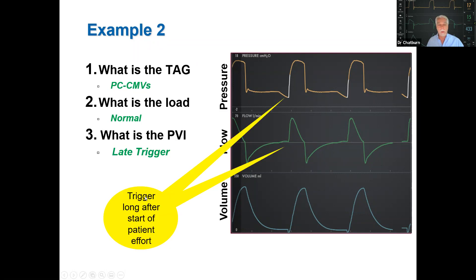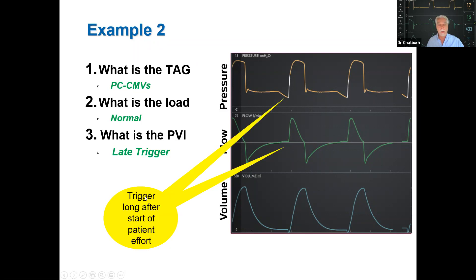Here we have evidence of a late trigger. The patient made an inspiratory effort — visible in both the pressure and flow waveforms — but it took a long time for the ventilator to catch up. On this particular ventilator, you can see it's a pressure trigger because the ventilator indicates a white section on the pressure waveform; if it had been a flow trigger, the white section would be on the flow waveform instead.